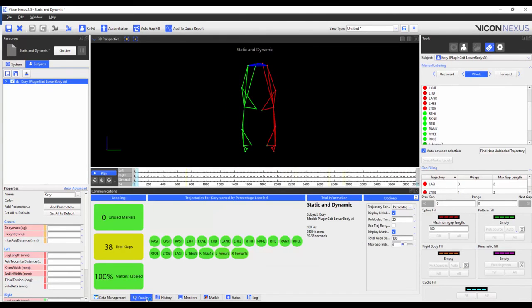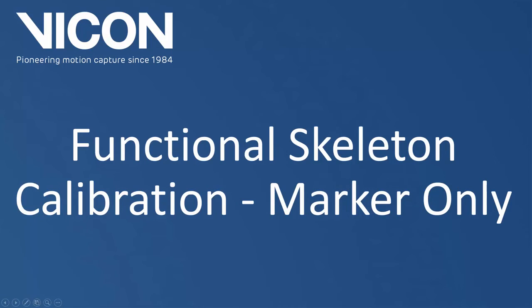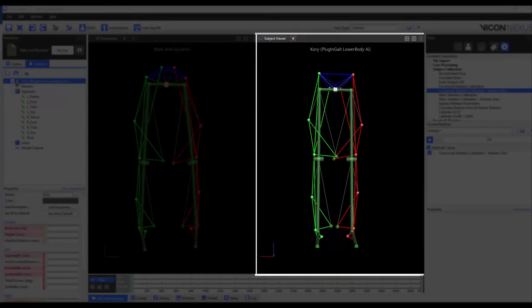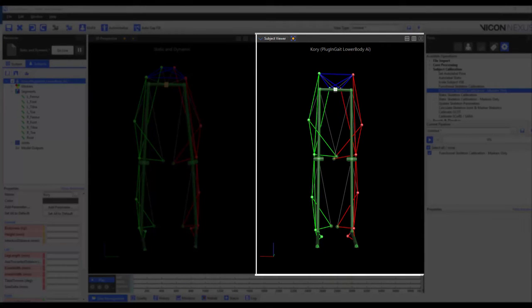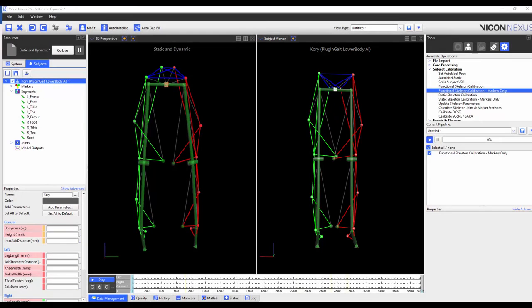Although there are still gaps, we do not gap fill. We can see in the subject viewer that my left and right medial knee markers aren't correctly aligned. To fix this, I'm going to run the functional skeleton calibration markers only pipeline operation.